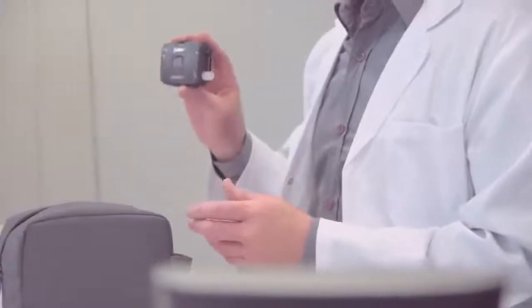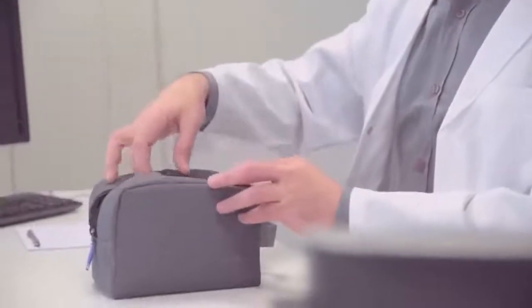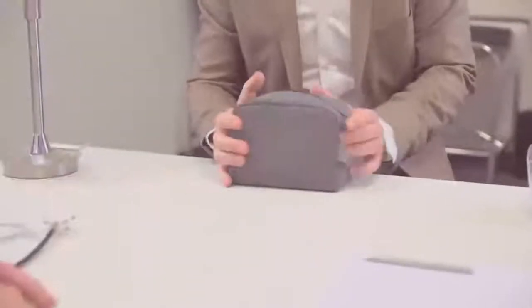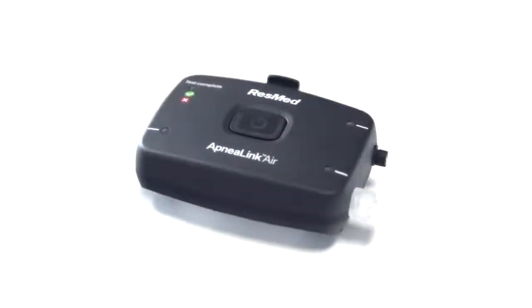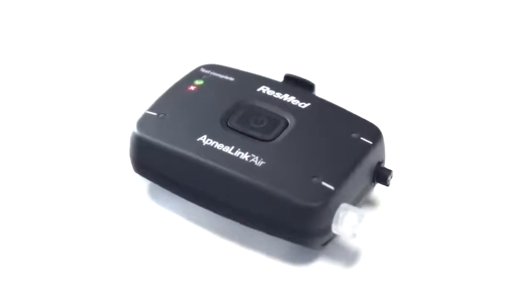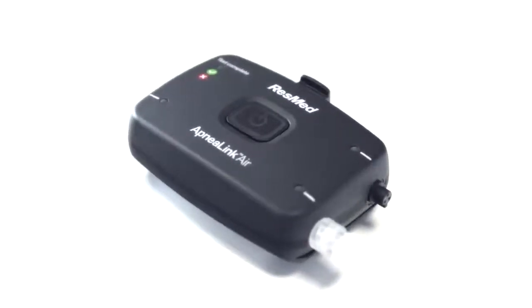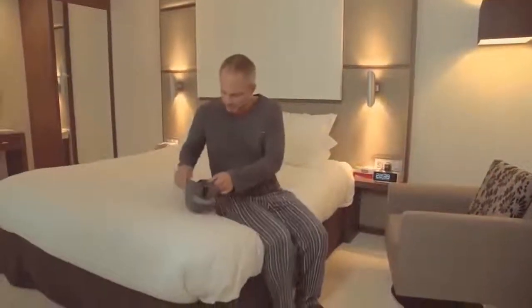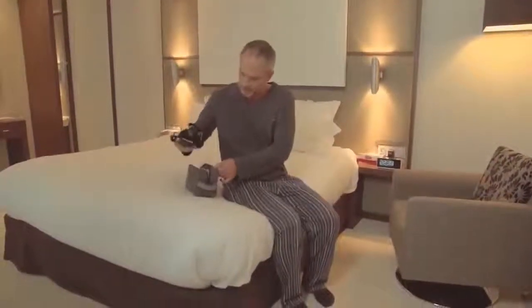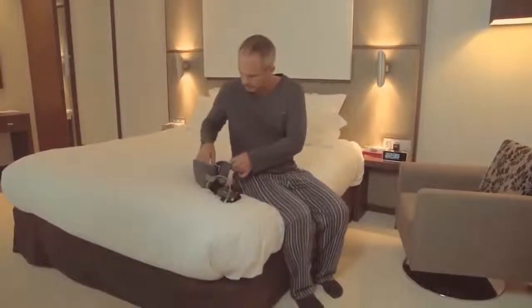Your clinician has recently given you an ApneaLink Air device to get tested for sleep apnea in the comfort of your own bedroom. Don't worry, it's simple and easy to use. ResMed ApneaLink Air is a device which helps to detect sleep apnea in one quick and simple overnight study. This short video will help to familiarize you with ResMed's ApneaLink Air and make sure you use it correctly and efficiently.